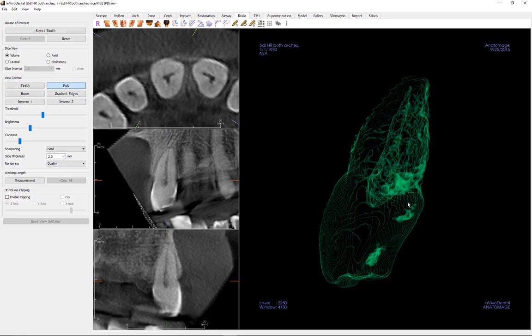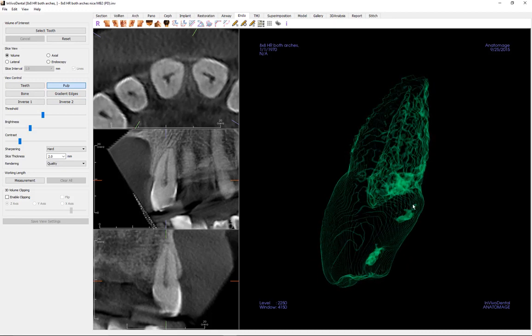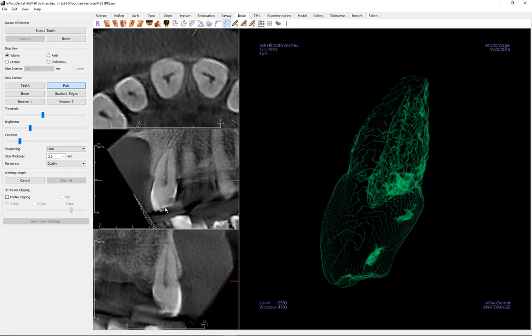Working length measurements can be performed in either the 2D cross-sectional views or the 3D pulp view to calculate root and endodontic file length. Simply choose measurement in the control panel, then place a beginning and an ending point from the crown through the visible canal.